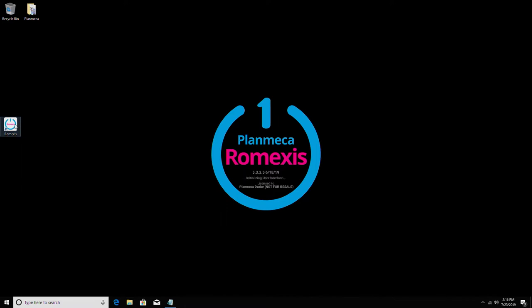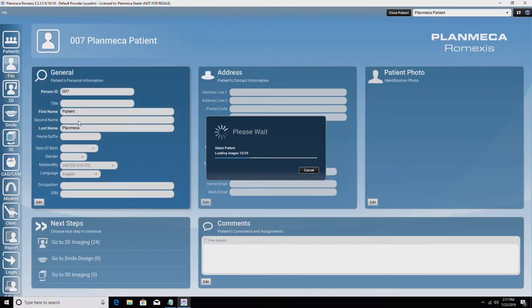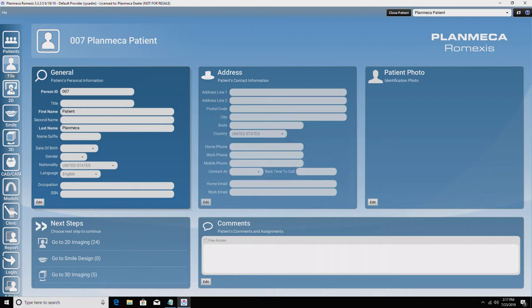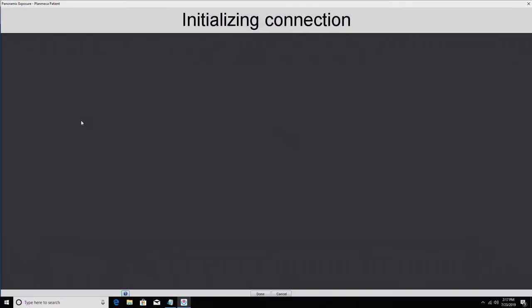Select the appropriate patient. Select 2D module from the menu on the left, or choose go to 2D imaging from next steps located on the bottom left of the patient dashboard. Select panoramic exposure from the 2D imaging dashboard or from the top drop-down menu.